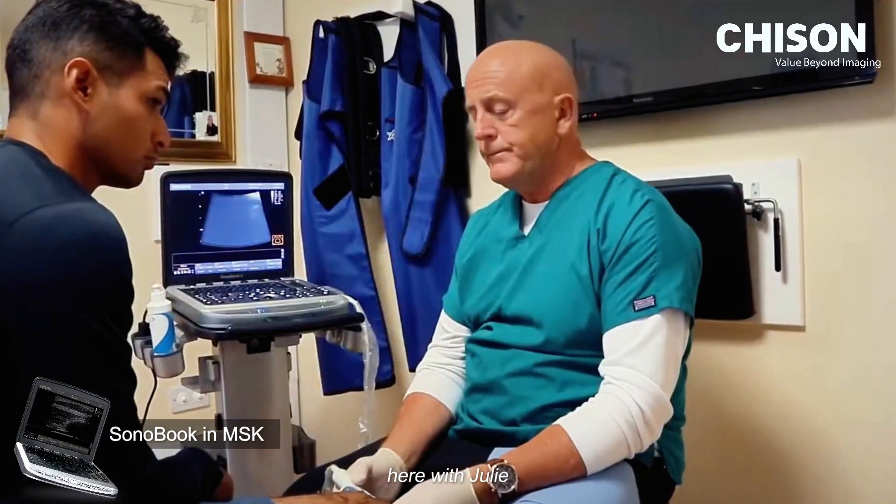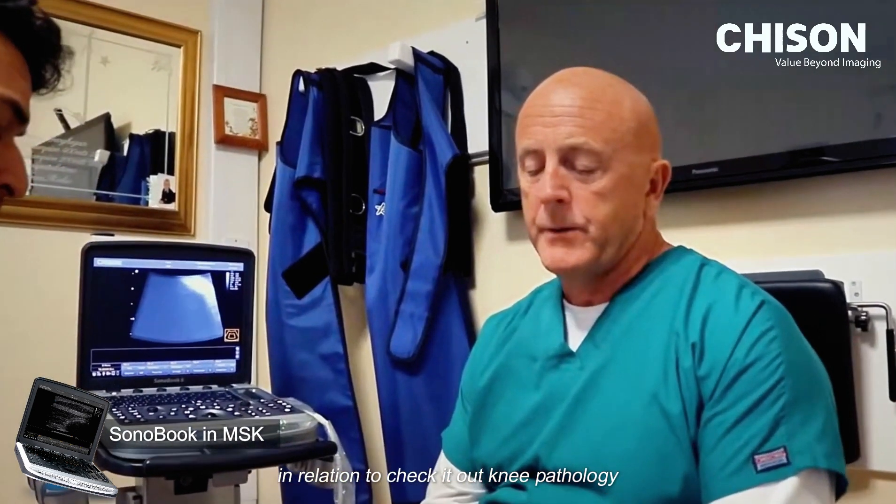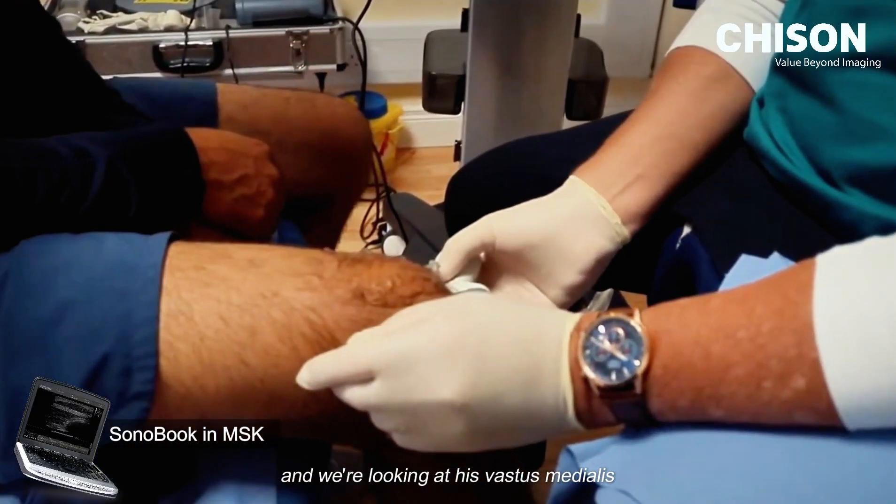I'm here with Julian, and Julian's a golfer. We're here using the Chison SonoBook 6 in relation to checking out knee pathology, and we're looking at the Vastus Medialis.